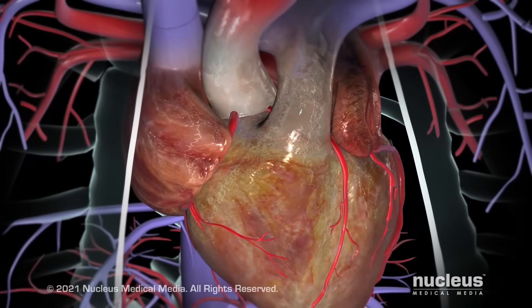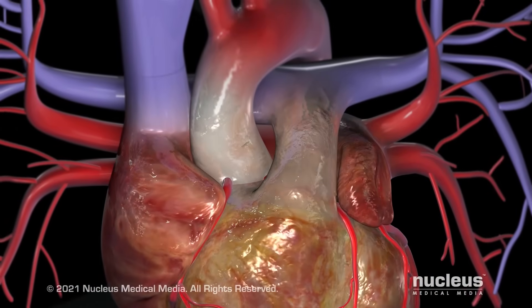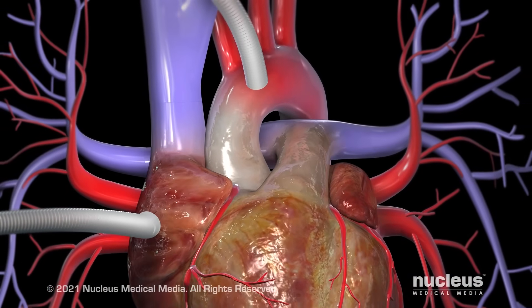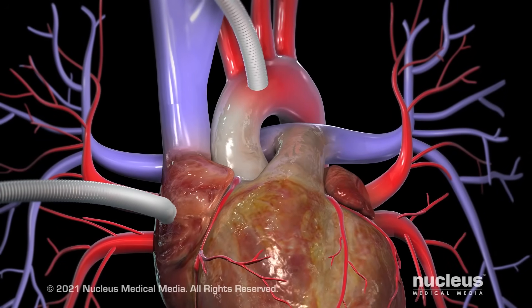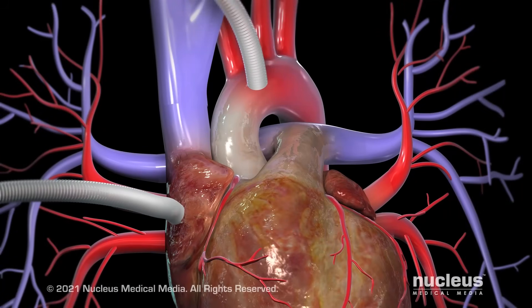Throughout the procedure, your circulatory system may be connected to a cardiopulmonary bypass pump, or heart-lung machine. This machine may temporarily perform the functions of your heart and lungs during the surgery, allowing your heart to be stopped, if desired, while the surgeon sews the grafts into place.